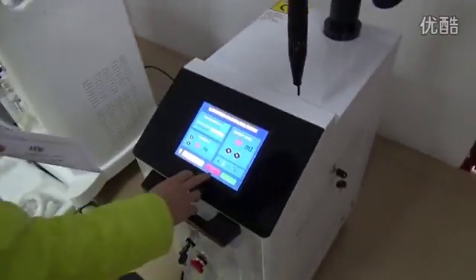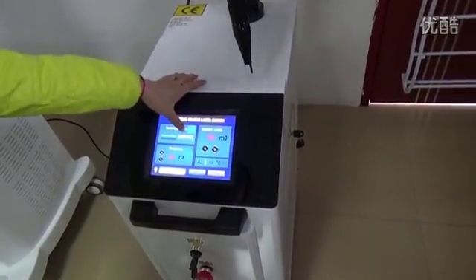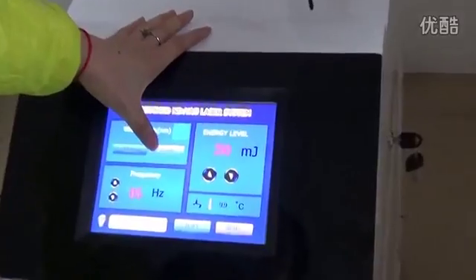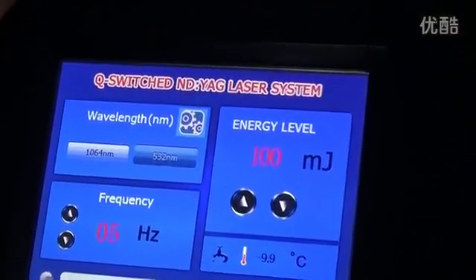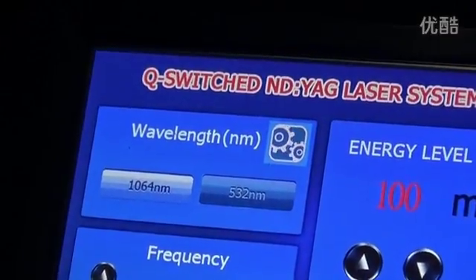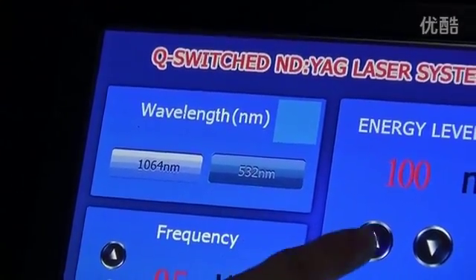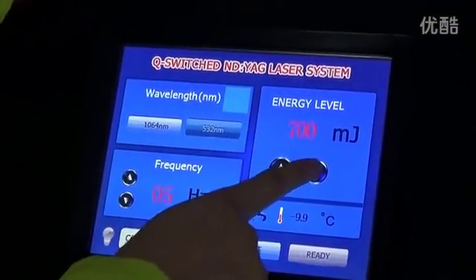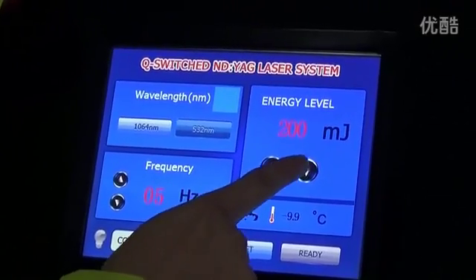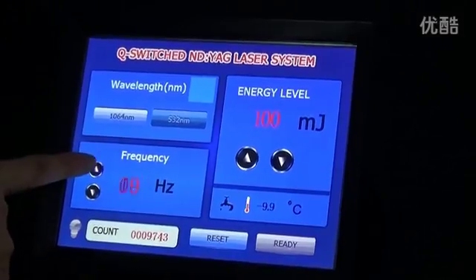After the treatment, press this button — press reset. Now adjust to 532 wavelength. This is the energy; the biggest is 800. And the temperature and the frequency. Also save.